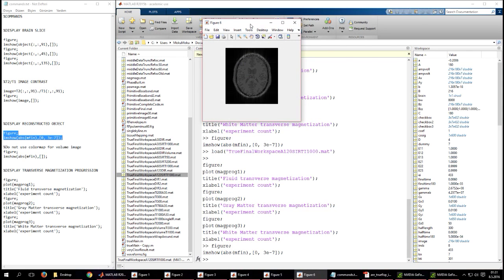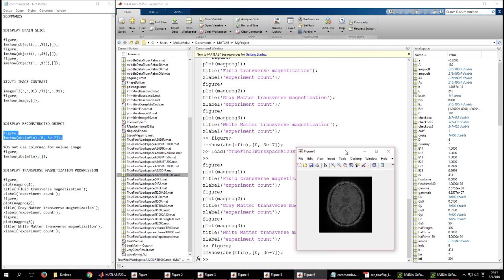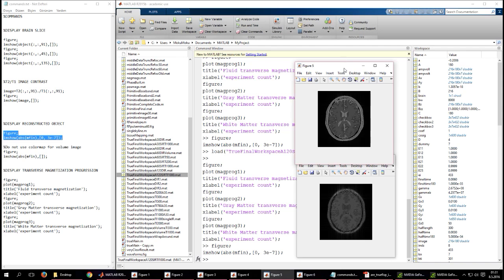In this image, you see some blurry shifts on the upper side and lower side of the image. Also, you see some horizontal linings throughout. They were also apparent in weaker form in previous results. I believe they are results of some sort of weak ghosting caused by the weighted K-space.